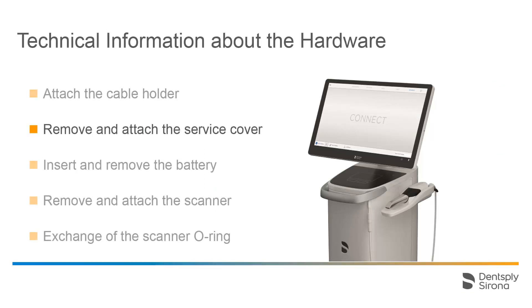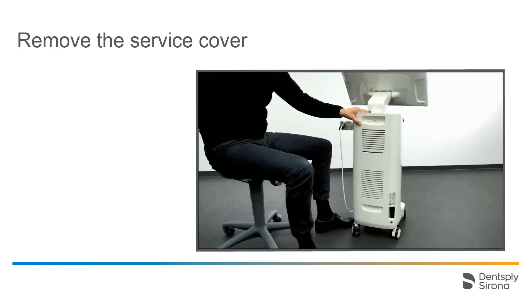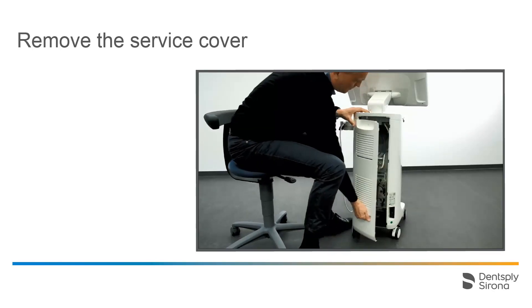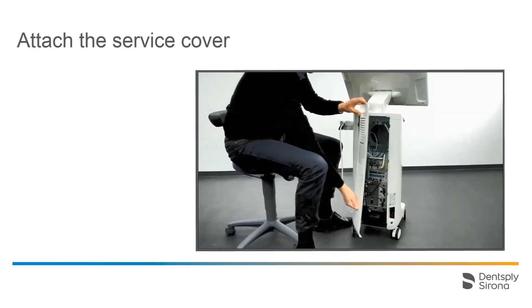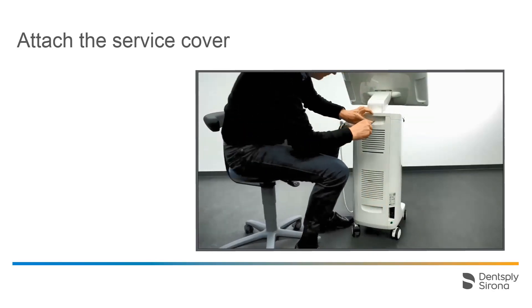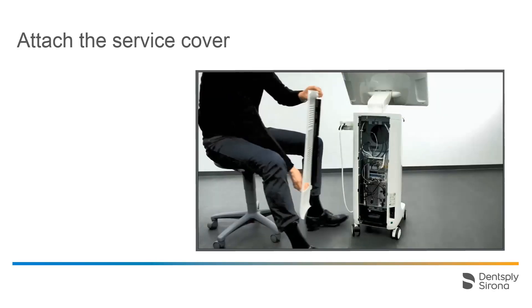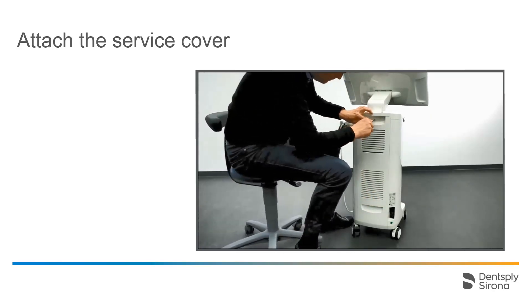To access different ports, such as HDMI and USB among others, you can remove and reattach the service cover. Use a flat-head screwdriver to position the screw slot vertically and pull the cover down. Several guidance latches are mounted on both sides of the cover and the back side of the Acquisition Center. These need to be aligned in order to remove the cover. To reattach the cover, make sure that the latches are on the same level and the service cover is evenly positioned against the Acquisition Center before pushing the cover into its final position. Then the slot of the screw head can be returned to a horizontal position.